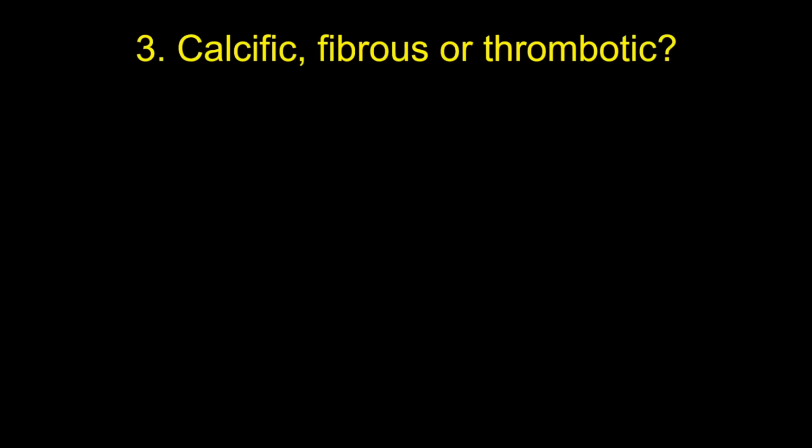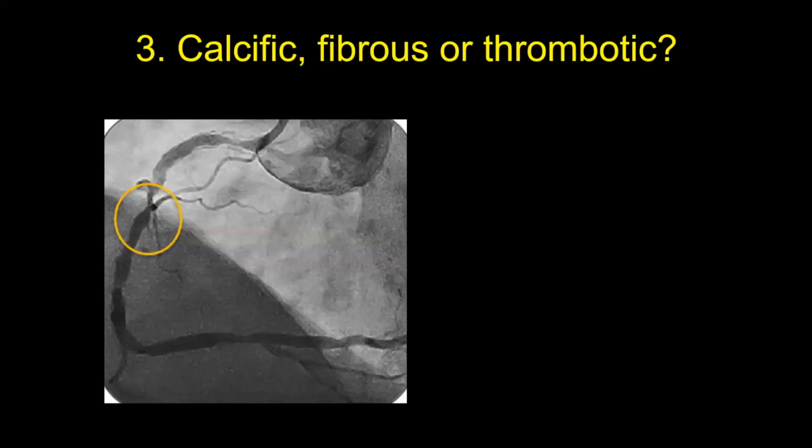Okay, who is going to do this one? Now there is only Suhail left, and I can select from one trainee. So we have just 3 more, and then we finish. Maybe Asim Chugtai. I'm not sure whether they are intervention trainees or not. That's fine. I think the beauty of OCT is that you don't need to be an interventionist. Any volunteer? Yes, I'm here. Okay, Sohail.